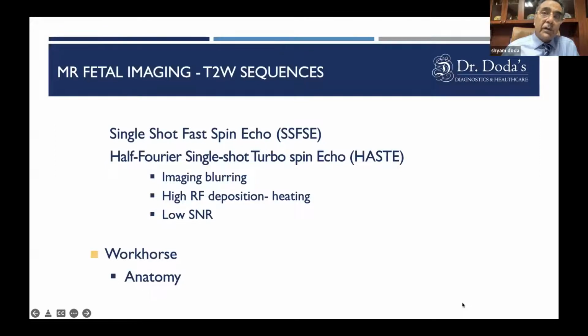One of the wonderful things about MR as compared to CT, X-ray or ultrasound is that you can exploit so many parameters in different manners. The T1 weighted pictures usually show water or any fluid as dark, and T2 weighted sequences usually show the water or hydration or edema as white.